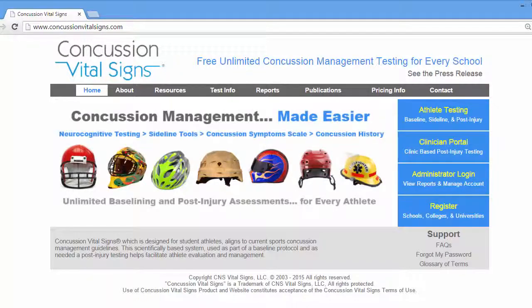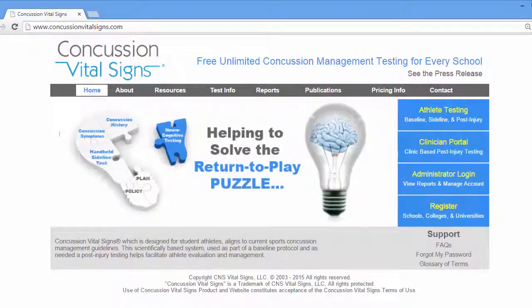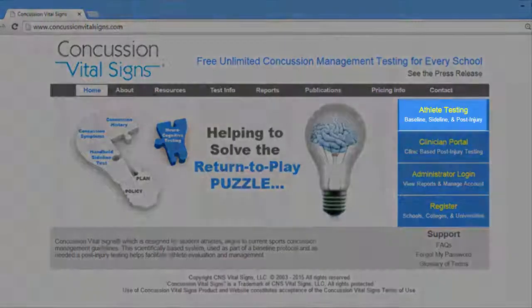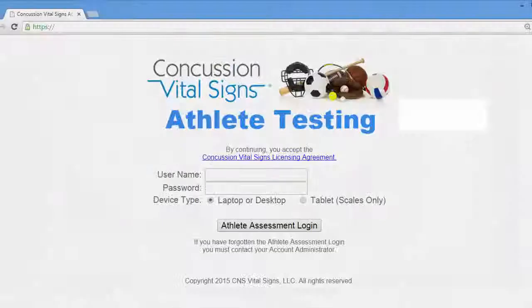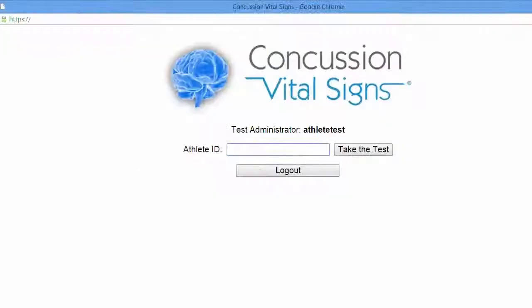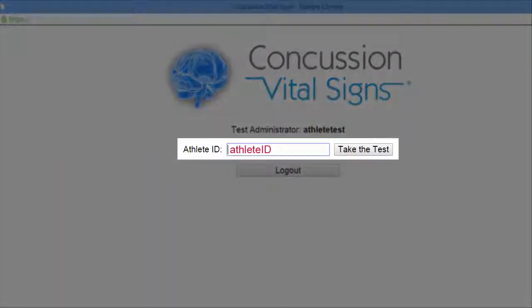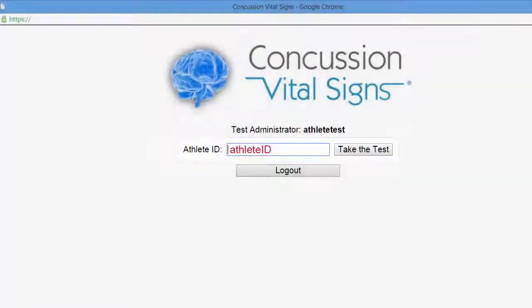Welcome to the Concussion Vital Signs Athlete Testing Tutorial. Begin at the Concussion Vital Signs homepage and click the top item, Athlete Testing. Log in with your username and password for testing — this was emailed to you at registration. Type in your athlete ID and then click Take the Test.